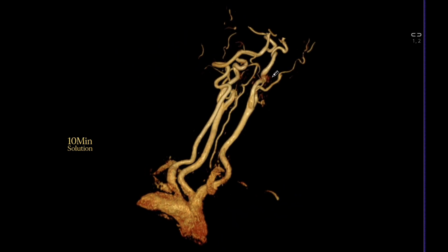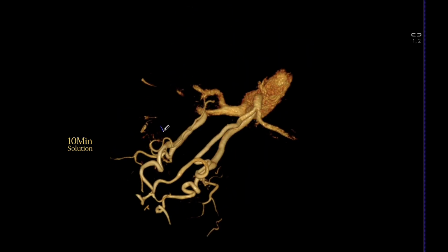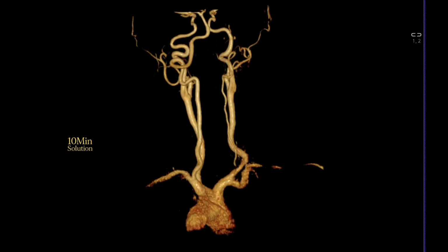Conclusion: MRA of neck vessels is a powerful, non-invasive imaging technique that plays a vital role in vascular diagnosis. With proper planning, optimized protocol, and advanced post-processing, we can achieve highly accurate and reliable results.